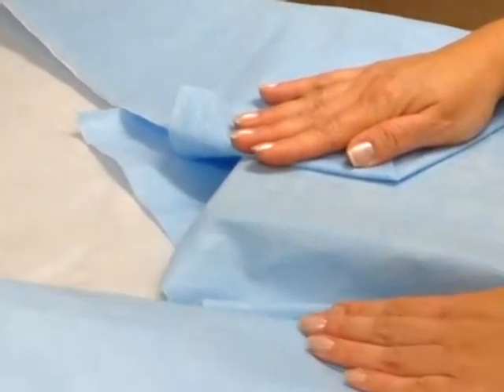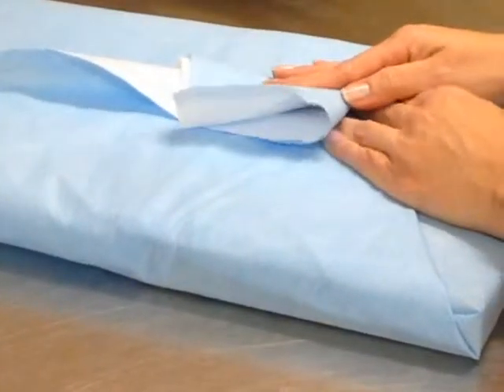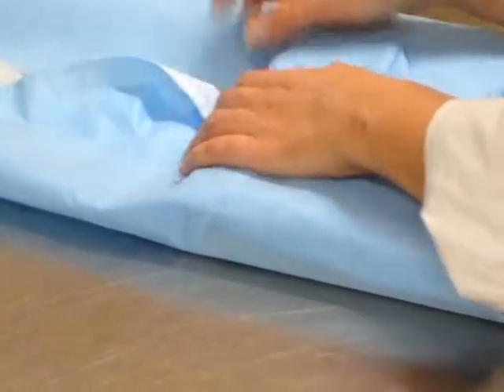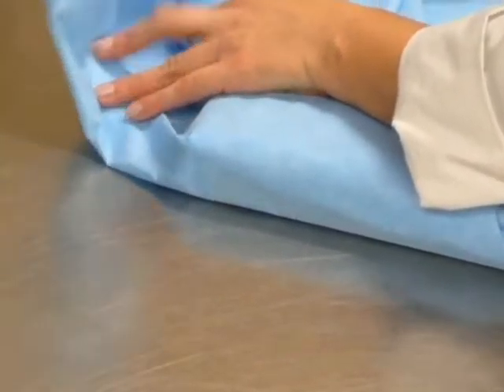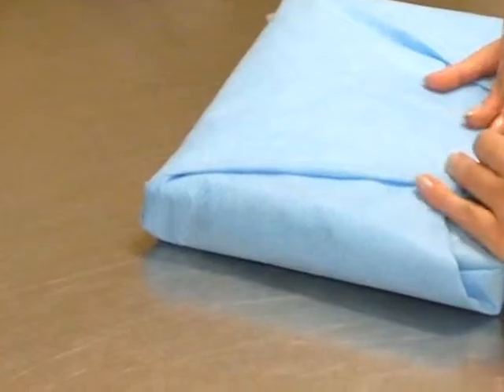Same thing for this side: fold it and make a tab, then a little bit here. Then bring this over.